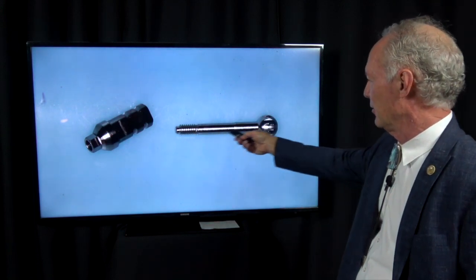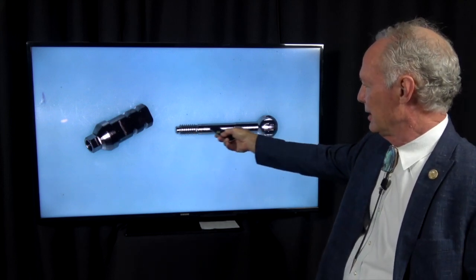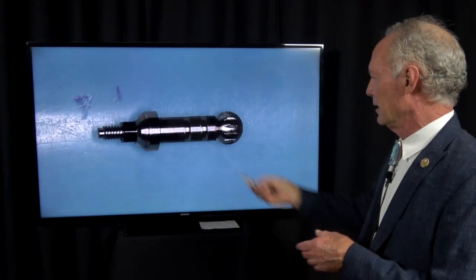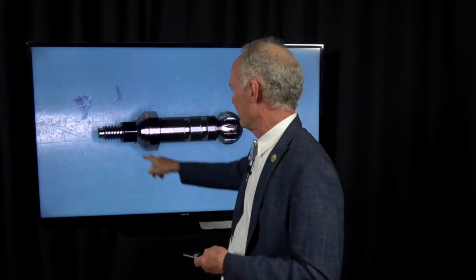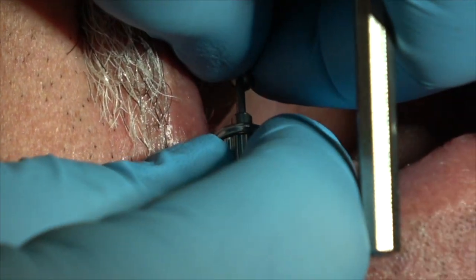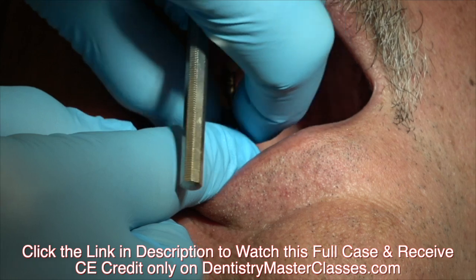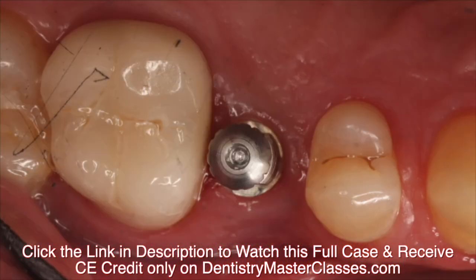This is the OCO impression coping. You're going to screw this into the implant and this hex fits perfectly into the implant. This screw goes through this part — here are the threads down here. When I put it in place, the hex is going to fit into that implant and it'll lock so you can't turn it. Then you're going to screw in this part and finger tighten it.